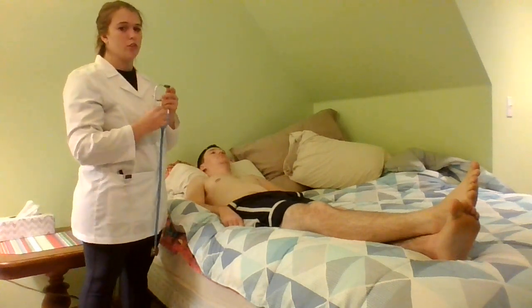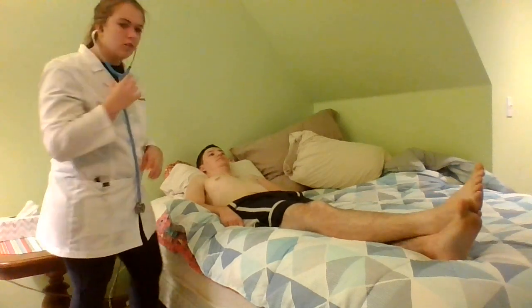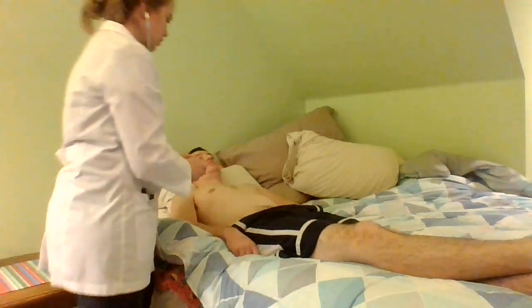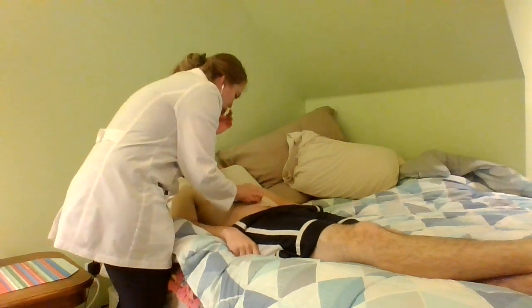And I'm going to be looking for any signs of bruit, which is a whooshing sound. I'm just going to bring this a little closer so you can see. Where am I supposed to be? Okay. So I'm going to start up here with the abdominal aorta.